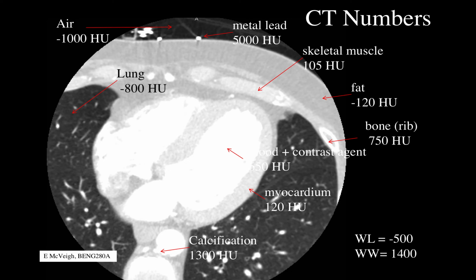So you'll get 1,300 Hounsfield units, and inside the lumen of the artery you have 300, and the broadening from the lack of spatial resolution broadens out this big signal and interferes with the stuff you're trying to see. So that's called calcium blooming. It's essentially just lack of resolution, right?